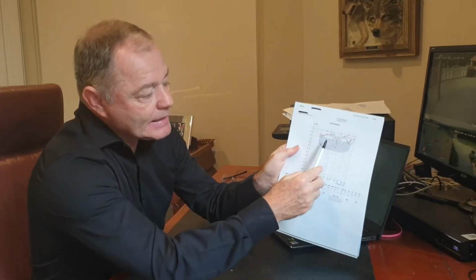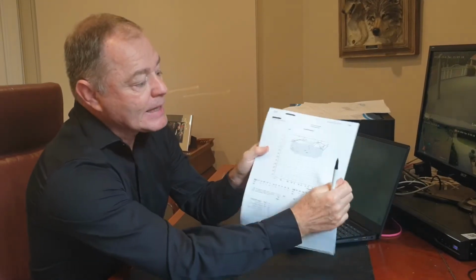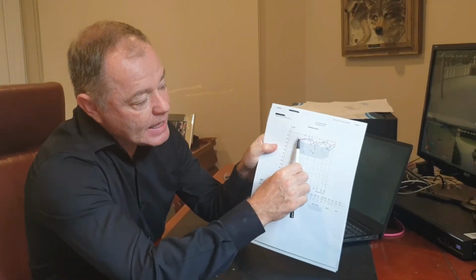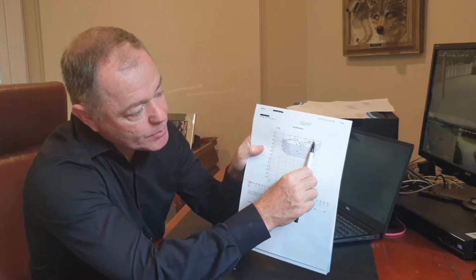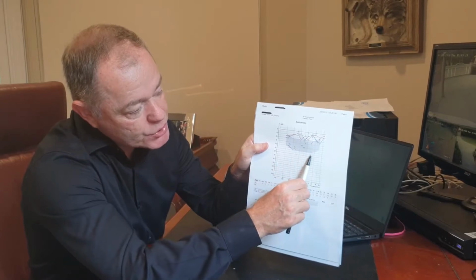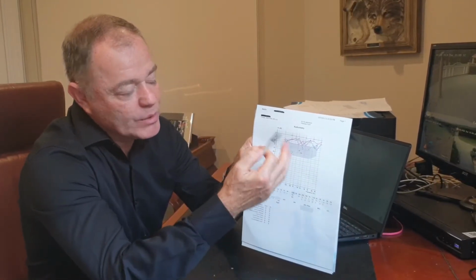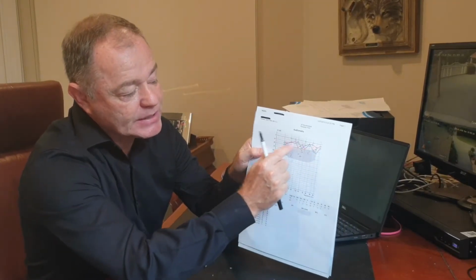So in this particular graph, you'll see there are two lines. There's a red line and there's a blue line. So the red always corresponds to the right and the blue corresponds to the left. And in this case, the two lines are very similar and they're fairly close to the top of the page. There's a grey box right here, and this grey box basically indicates what we call a speech banana, and it shows you where all the different sounds in speech typically lie.